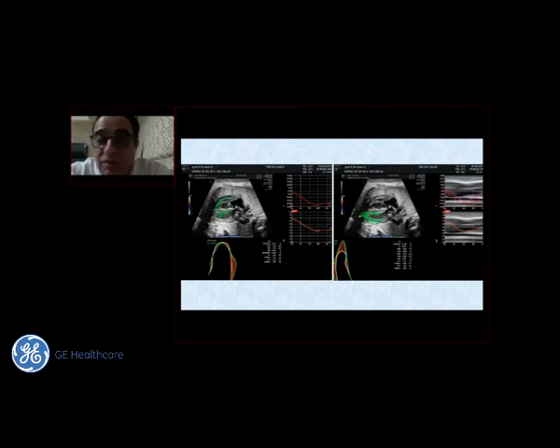an FGR fetus. I cannot cover it in just one sentence, but these are parameters that we need to look at. We have definitely good criteria on Doppler. This is a research tool yet, and a lot will be coming out of this in the coming years.